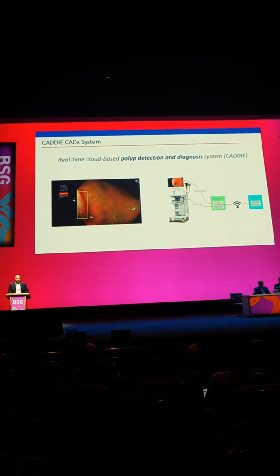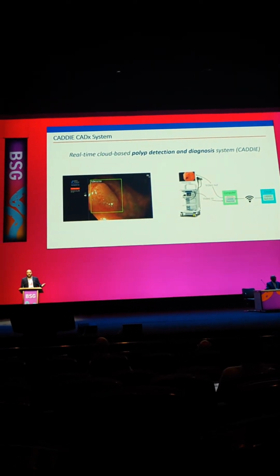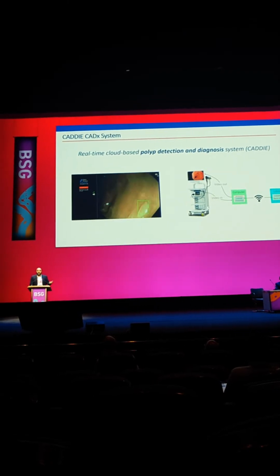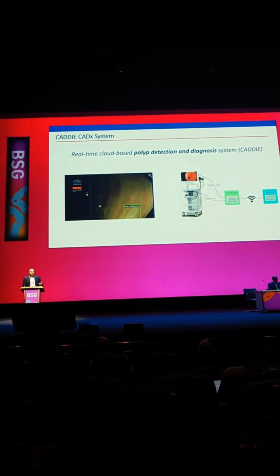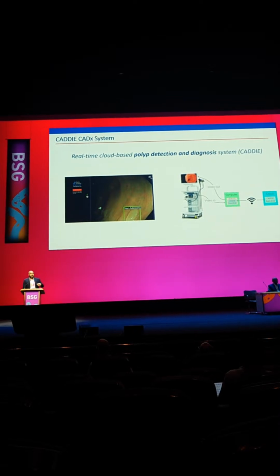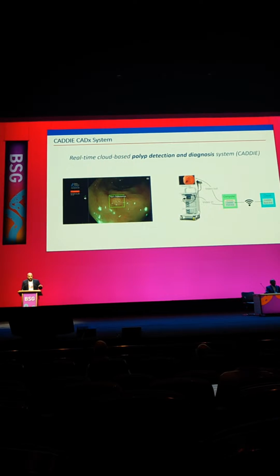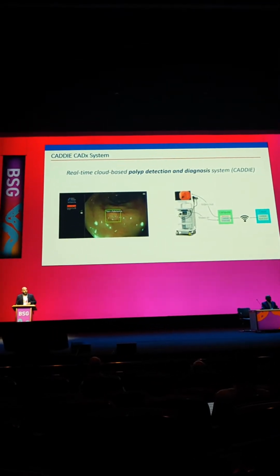Now, the reason why this is so important is we're quite early on in the translation of AI, believe it or not. We're going to have much larger training data sets. We're going to have multiple new updates, new versions of existing models. In CADx, we'll have new classification models. We'll have new systems that will be developed. And what this workflow lends itself to is that on the back end, all of this can be implemented.